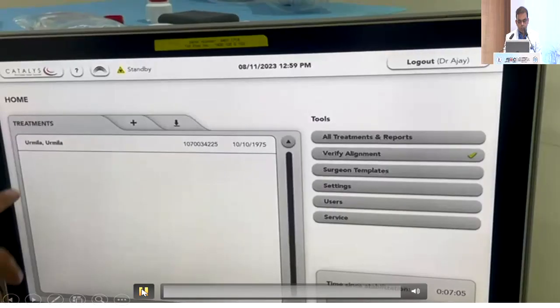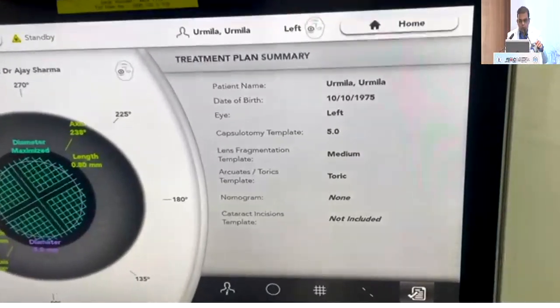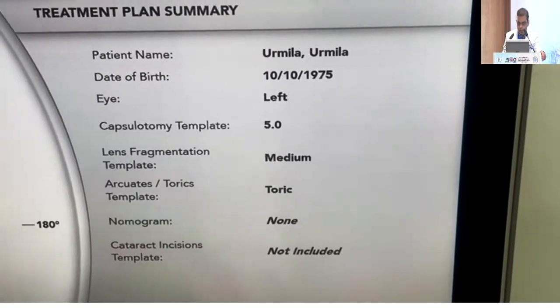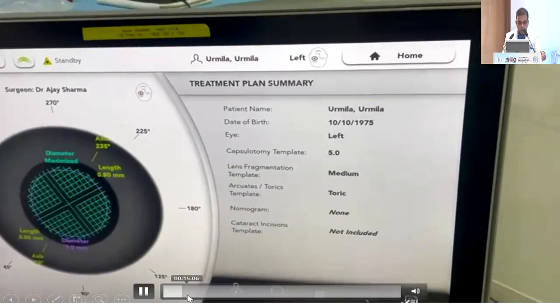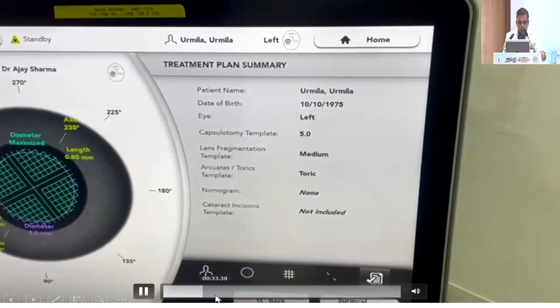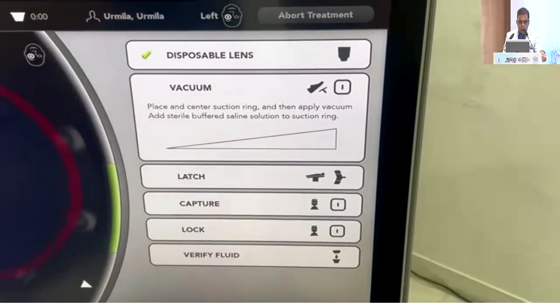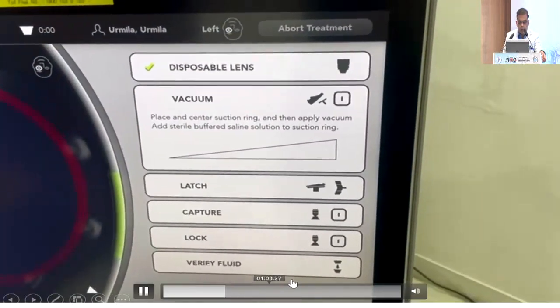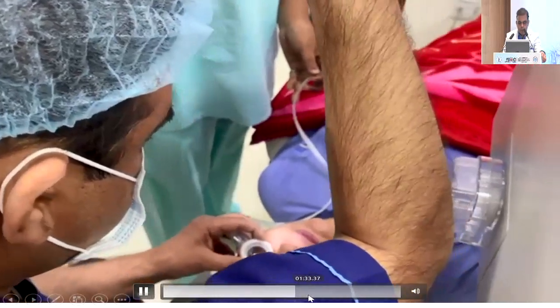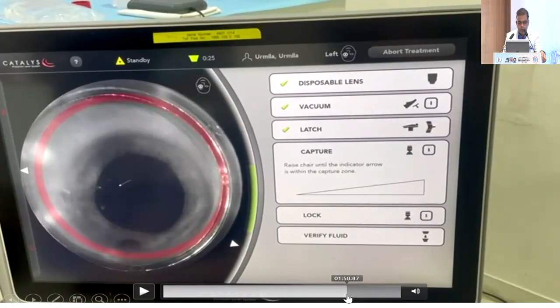This is how it looks in the FLEX system. This is the treatment plan summary. This is the capsulotomy we planned. We then proceeded to making the vacuum and the initial docking. It was done very well without any problem.